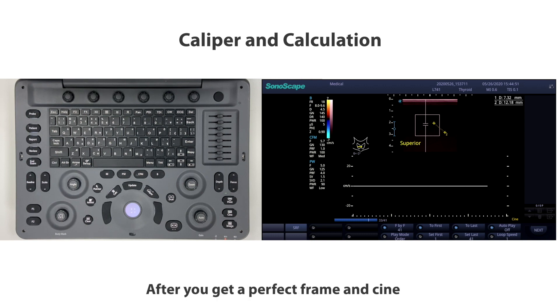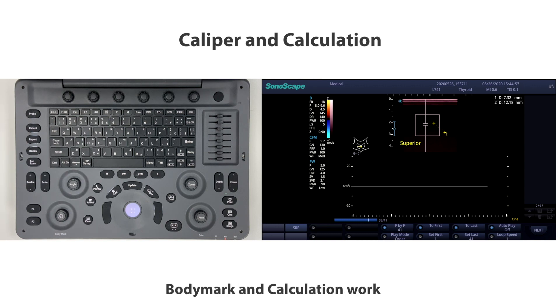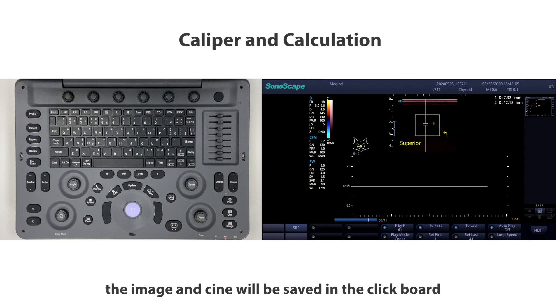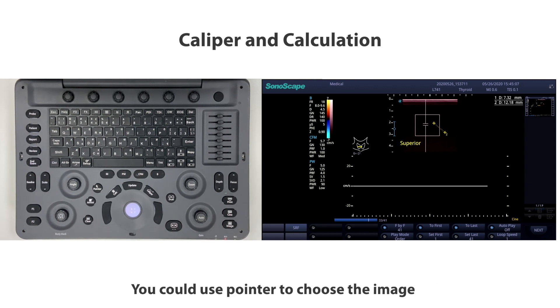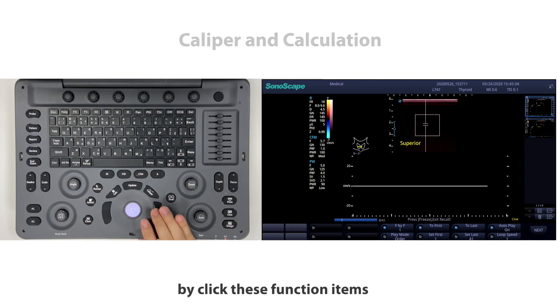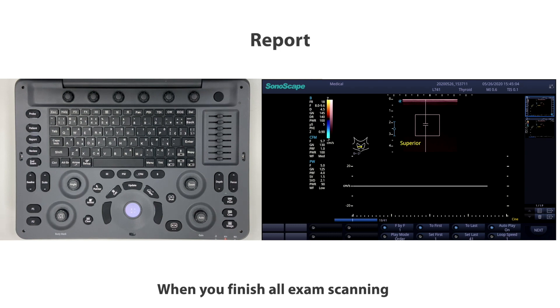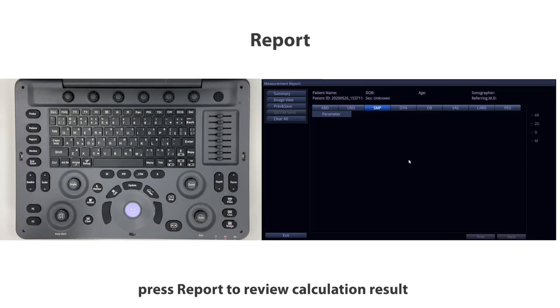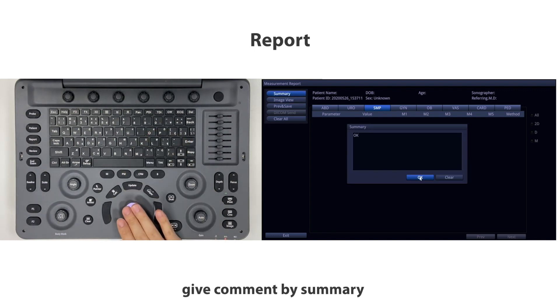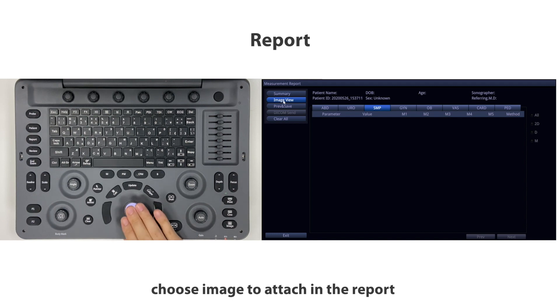After getting a perfect frame in cine or finishing all annotation, body mark, and calculation work, press the Cine or Image button directly. The image in cine will be saved in the clipboard. Use the pointer to choose images to review and manage them by clicking the function items. When you finish all exam scanning, press Report to review the calculation results and give comments via summary, and choose images to attach to the report.